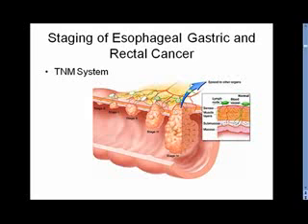Here are lymph nodes. In these cases, they are not involved, and here these green lymph nodes are positive for metastatic cancer, so this would indicate a nodal stage of 1 or 2 depending on how many lymph nodes and in which location are affected.